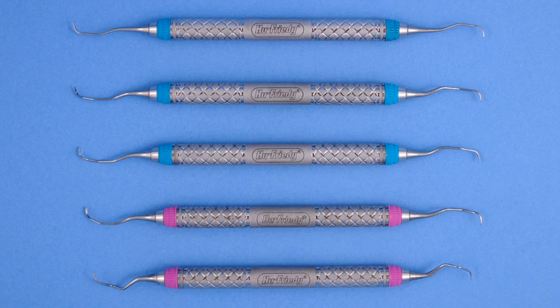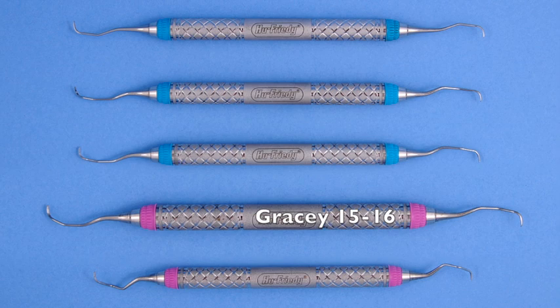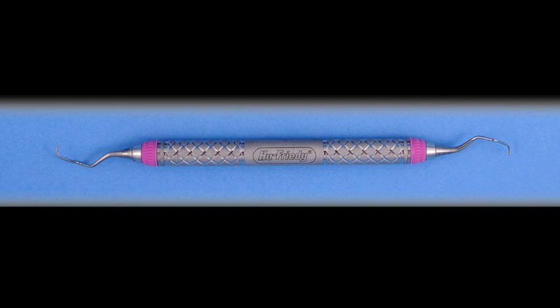The Gracey Curette series of periodontal instruments were designed by Dr. Clayton Gracey. Each instrument in the Gracey Curette series is area-specific, designed for use on certain teeth and certain tooth surfaces.